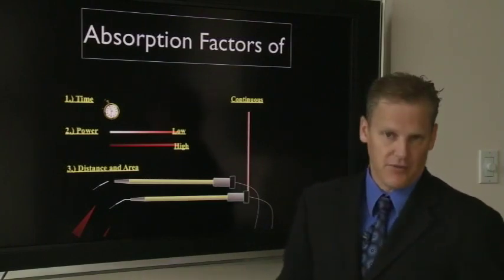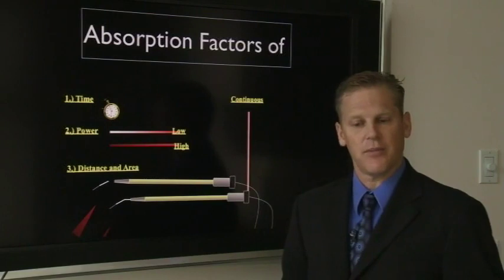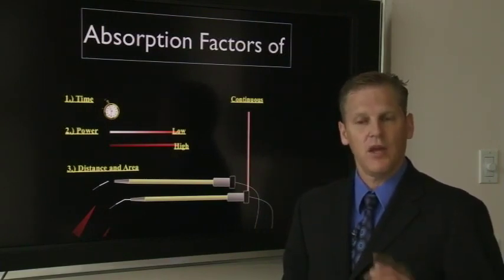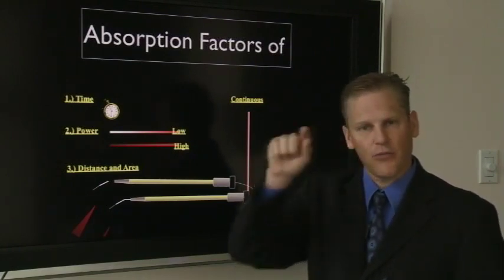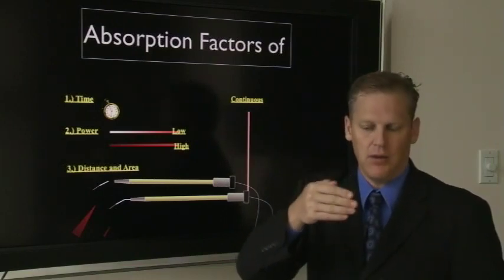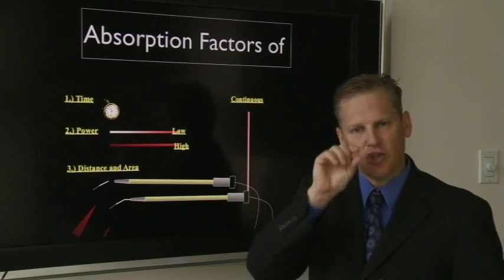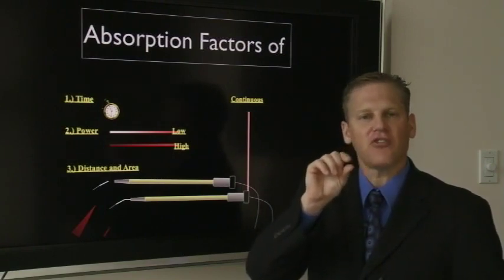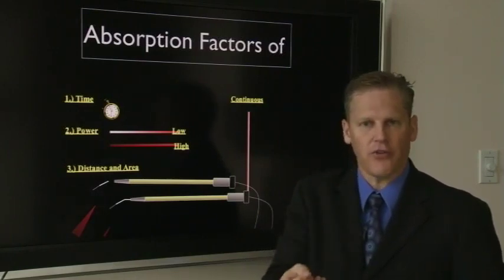There are two different types of lasers, really. There's a continuous laser. A diode laser is continuous. You step on the pedal and the energy is on. It's called continuous wave. What they've done in diode lasers is they've got a little mirror inside and that will rotate. And as it rotates, it can chop your beam up or gate the beam. It's not an actual pulse, but it will get the beam cut up and chopped up so that you can actually give the tissue a chance to relax instead of having just the energy on all the time.